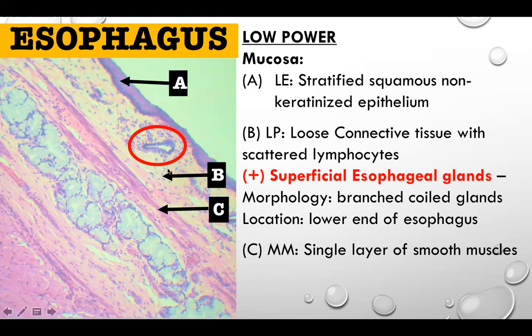In the lamina propria, if asked to identify the fundamental type of tissue, the answer is connective tissue. A subtype would be lymphatic tissue, specifically loose lymphatic tissue. If the specific subtype is connective tissue proper, it is also loose connective tissue. Letter C, the muscularis mucosa, is a single layer of smooth muscle that also divides the lamina propria from the submucosa.